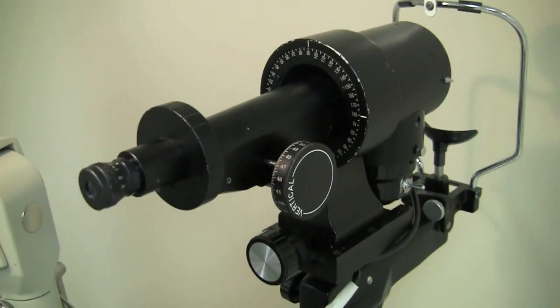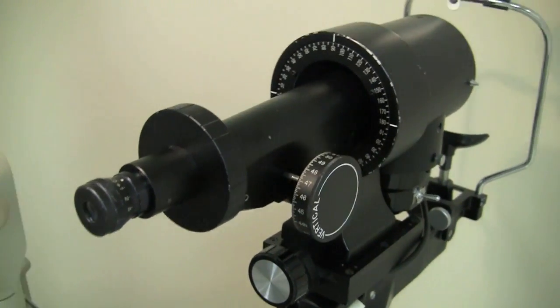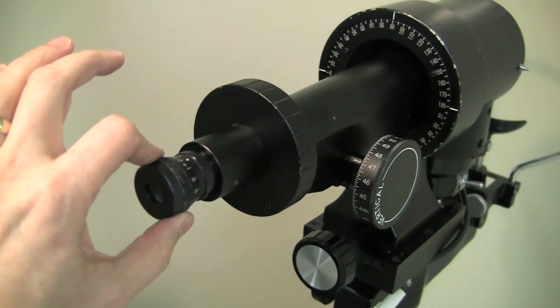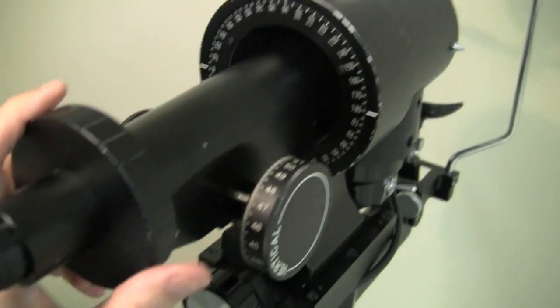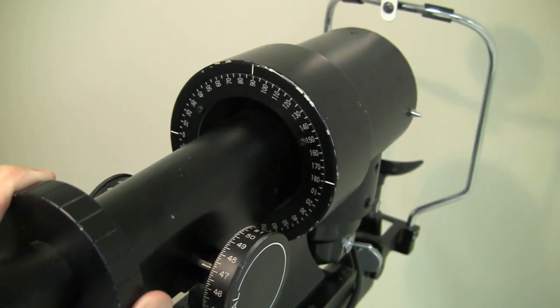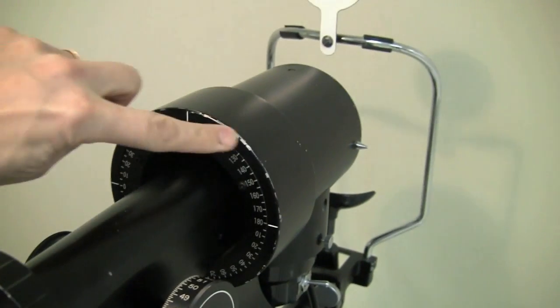There are a few features of the instrument that you're probably already familiar with. This knob focuses the eyepiece, which is an important first step in using the instrument. You can turn the barrel of the instrument like this to try to measure different astigmatic axes for the cornea. And you see the protractor scale here.